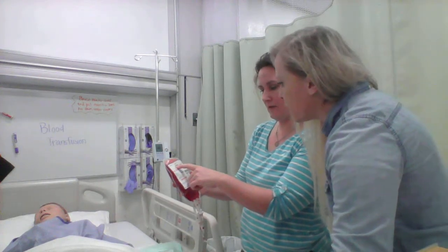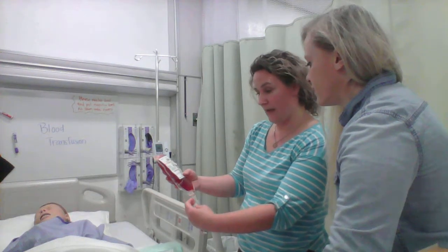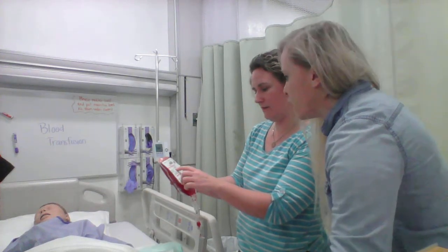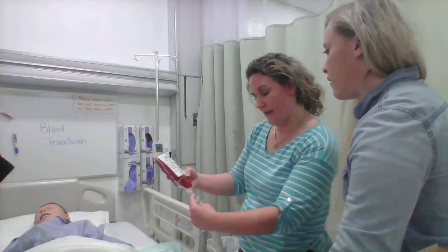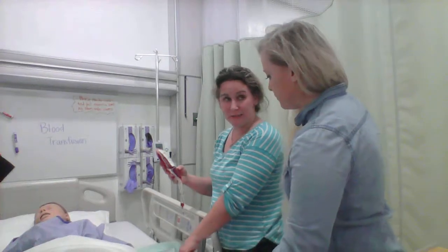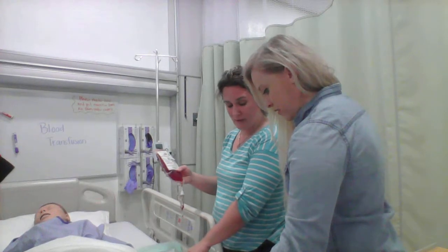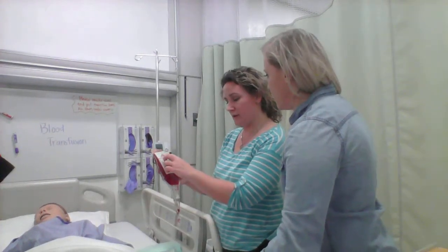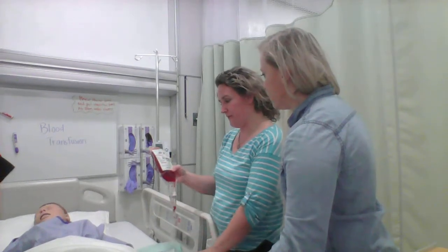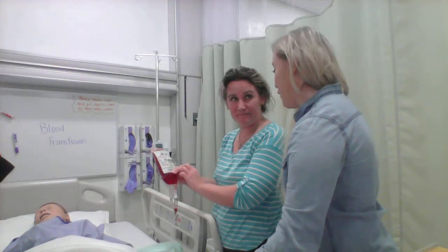Okay, 0049408. Good, and that matches 0049408. Yep. And then we're going to do the transfusion number. 06936003. And that matches down here. And then we're going to look at the patient's band to verify his name and date of birth. Yep. And that matches. And then his blood band also matches the record number and the transfusion number and the order number and the unit number, a whole bunch of numbers, and his blood type. Okay.